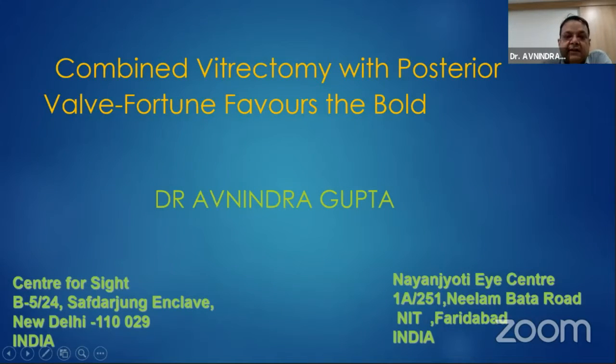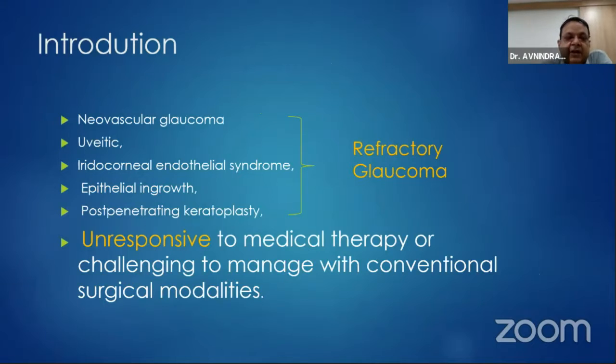What I'll be talking about is combined vitrectomy with posterior valve. Fortune favors the bold. I don't know whether I'm bold or it's a demand of time where we have to take unexpected steps to save the patient or to preserve the vision of one-eyed patients who are going blind. And that's why we came up with this procedure called posterior valve.